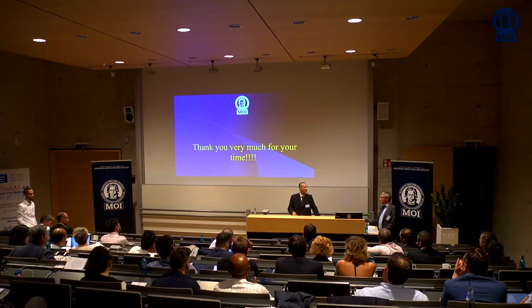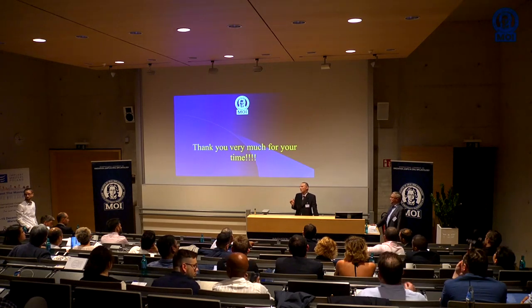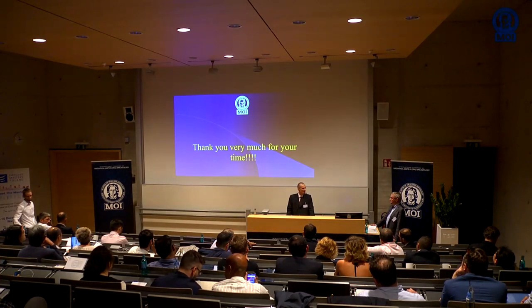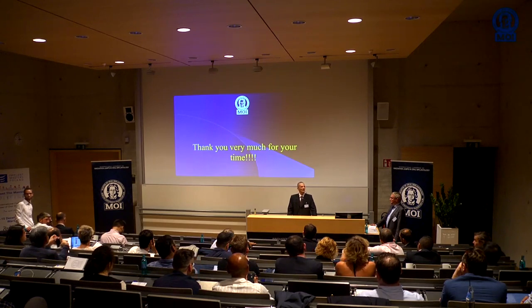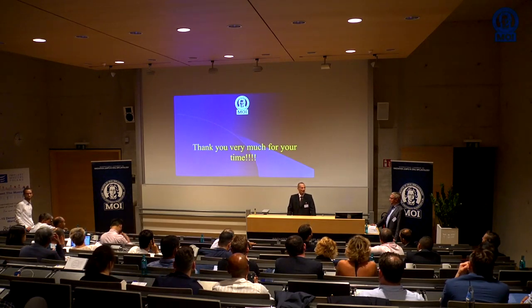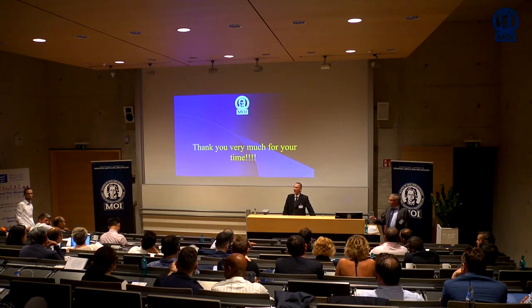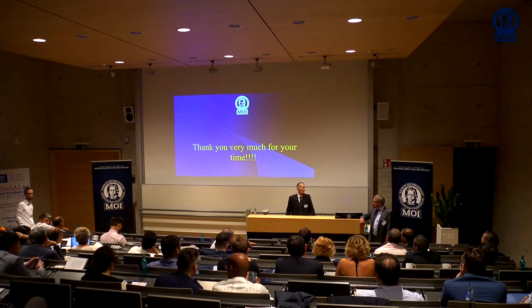So they send the patient back, asking us to please trim the tip of the implant and level it with the bone. So it's becoming a critical factor to have at least a limited amount of bone on the tip of the implant, to assure not only the long-term stability of the implant, but also not to get involved with sinus problems. It's very difficult from the clinical standpoint to explain to a patient why the ENT can't get rid of an ENT problem, and when the doctor sends the patient back to our office, it's very difficult to explain what we have done. So it's just a preemptive measure. After that, I started using shorter and shorter implants to allow for more bone on top of my implants.